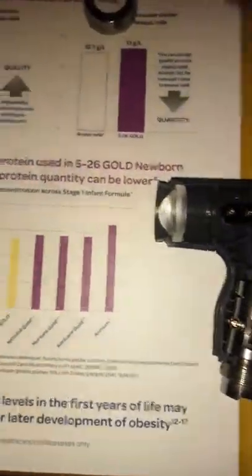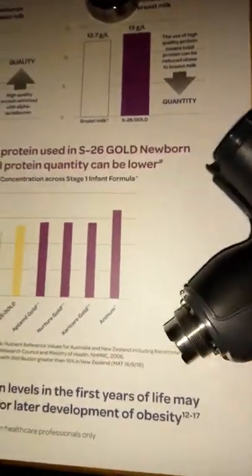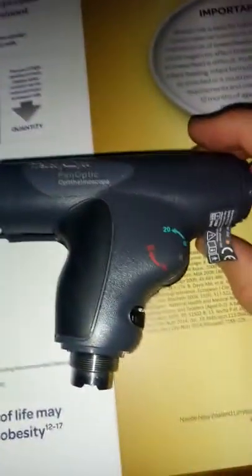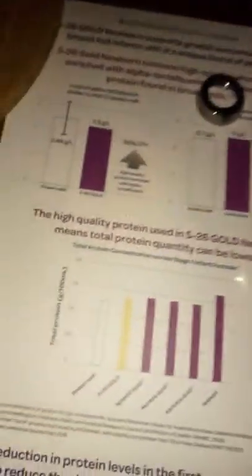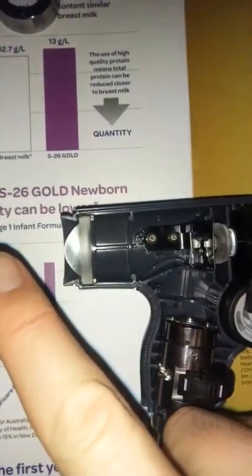Do it on the flat, and the side that comes off is the side facing to the right, if you were holding it as though you were using it, that's facing to the left. Inside, you see this mechanism. So down here, this is the torch. The light bounces up here off this mirror and goes out through there to the patient's eye.